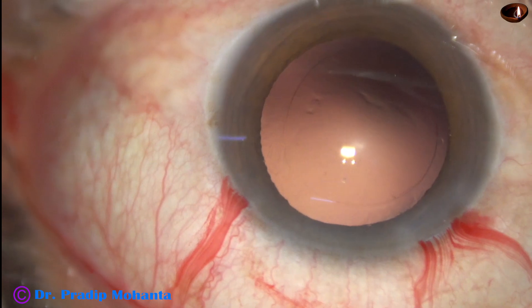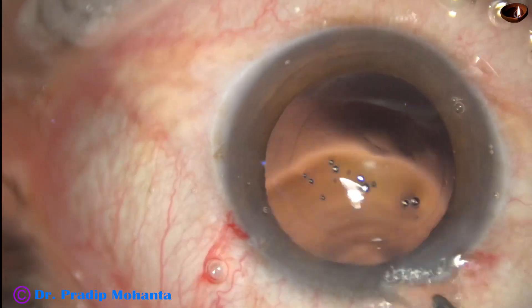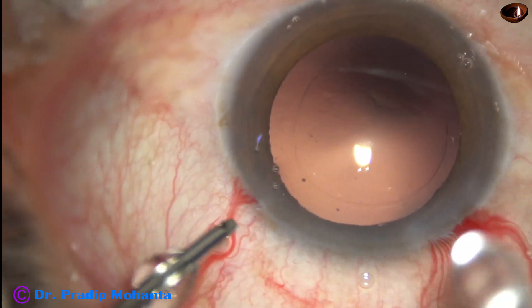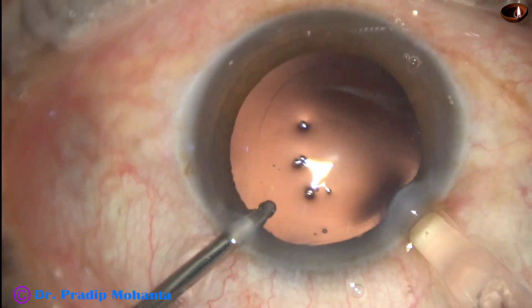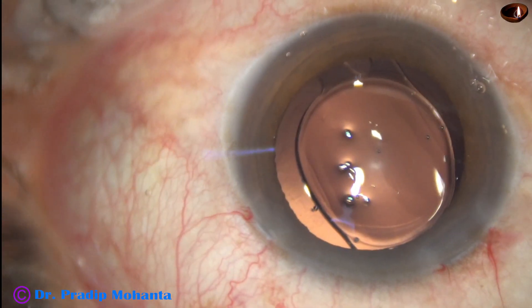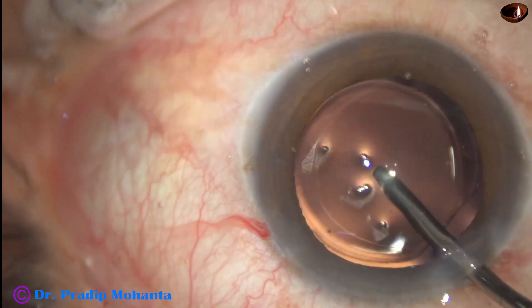The posterior capsule is very clean. Now is the time to implant an intraocular lens. This is called hydro implantation — the anterior chamber is kept maintained by irrigation and the intraocular lens is injected into the capsular bag. Then irrigation is used to remove the visco that was in the cartridge.